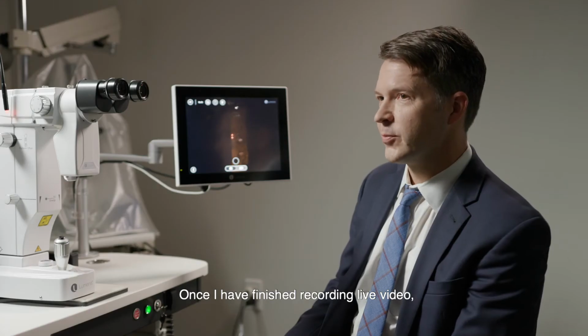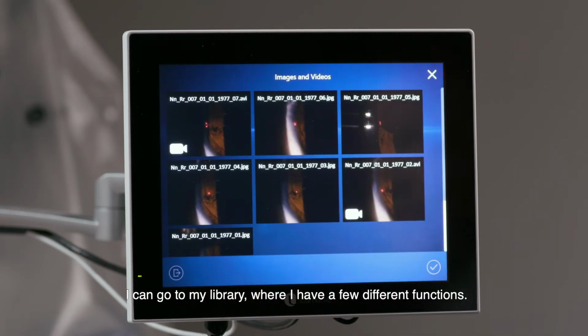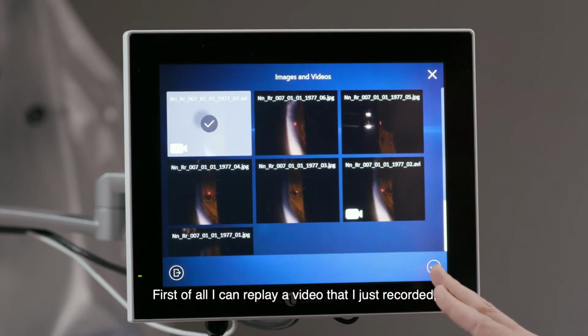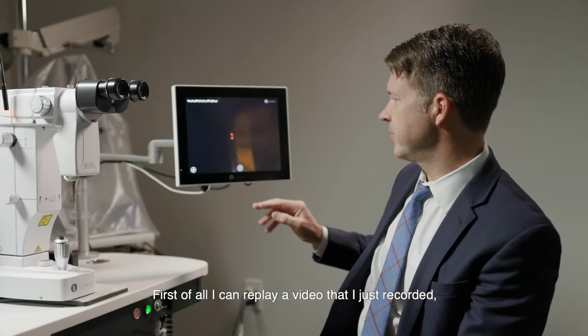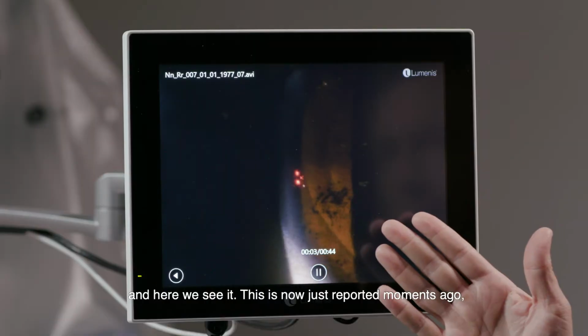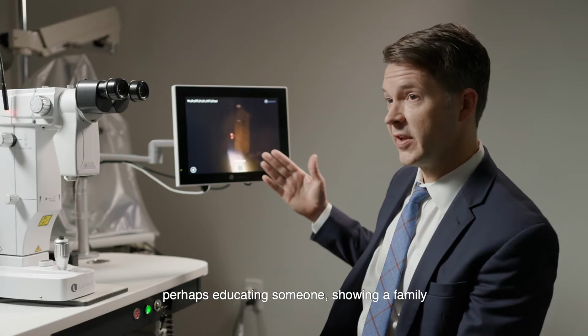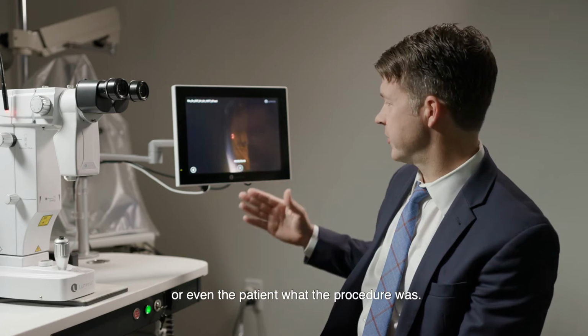Once I have finished recording my video, I can go to my library where I have a few different functions. First of all, I can replay a video that I just recorded, and here we see it. This is now just recorded moments ago, but I'm watching it again, perhaps educating someone, showing a family, or even the patient what the procedure was.